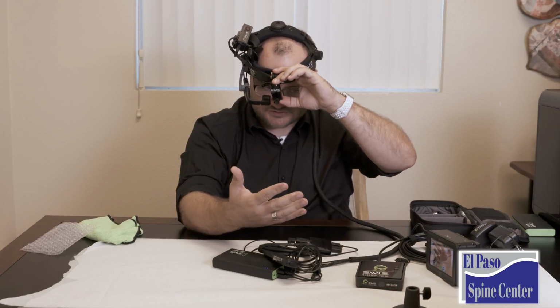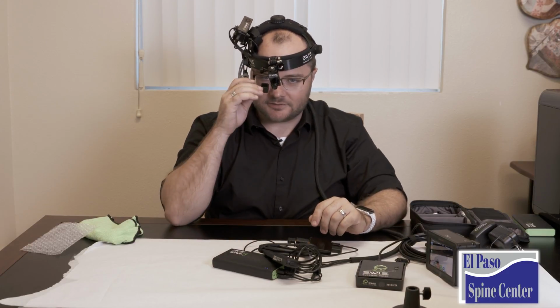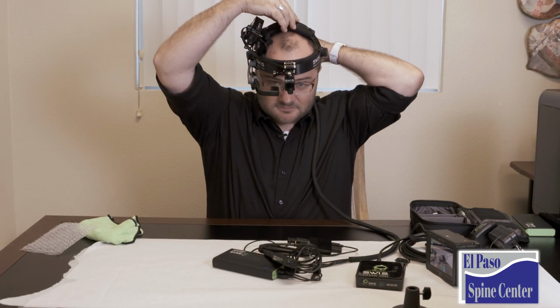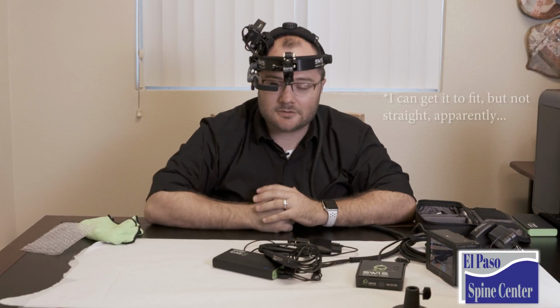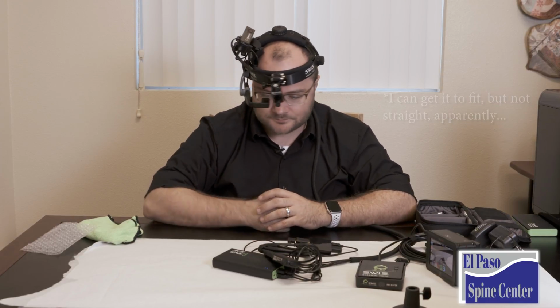I can readjust the position so I can get it in the right position for surgery. I'll be able to see the input signal right here. I can adjust the tightness on my headgear so that it fits nice and tight. I'm not going to go anywhere.